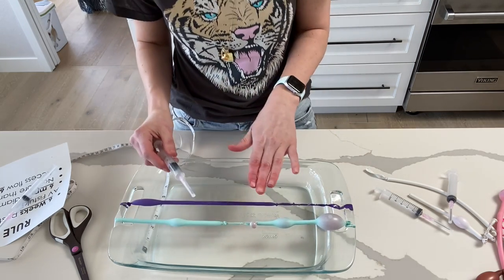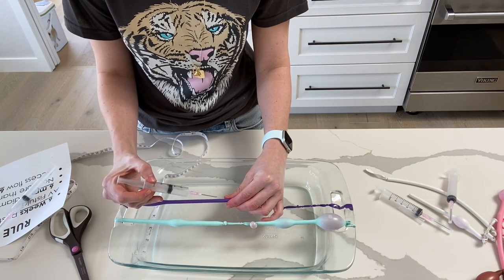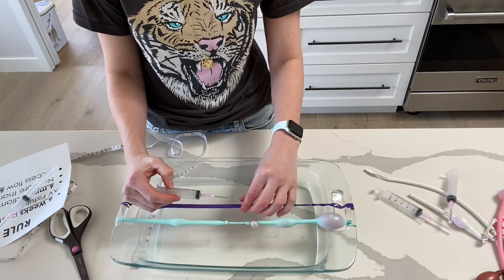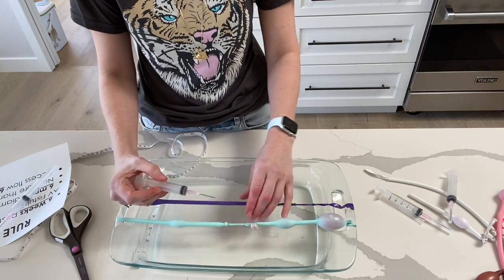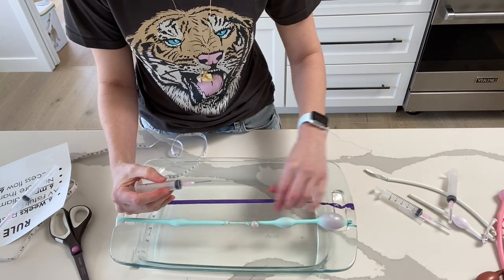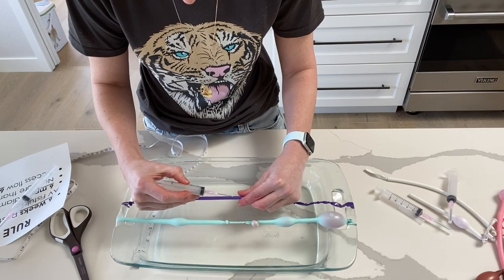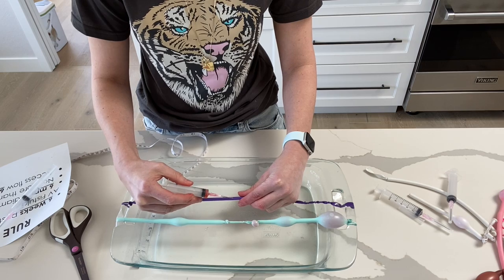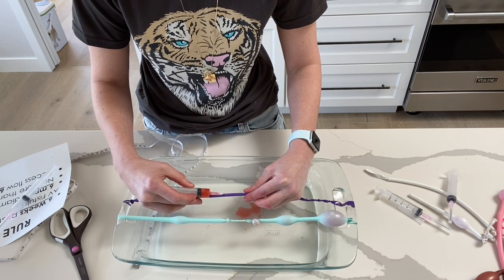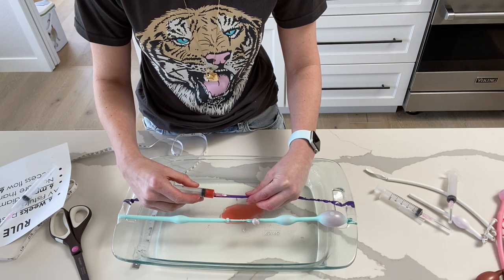Let's give it a start. My hands are red because I put red food coloring in there. When you put this needle in, you need to advance it slow. Once you get blood return, you always want a pulse as you advance that needle. My balloon fistula doesn't have a pulse, so I'll pull back on the syringe to make sure I'm still in the fistula. I've got my tourniquet on. I'm going to put the needle in — it's spraying, but you can see my syringe is filling up. I kind of went through the bottom, getting a drip — I went through the fistula. As I came back out, I felt it let go and was able to advance the needle the rest of the way.